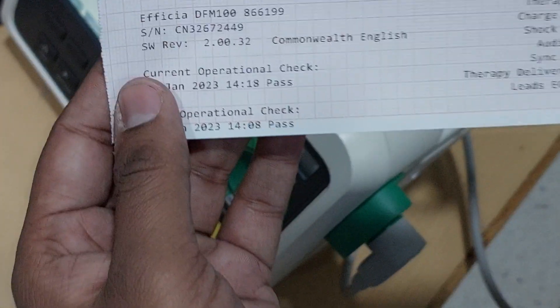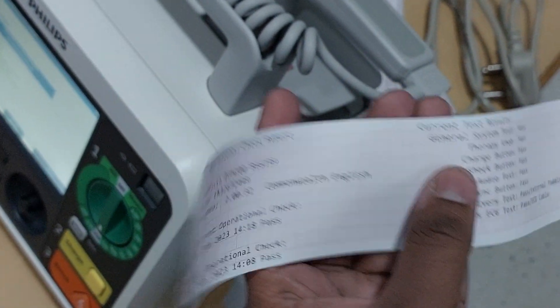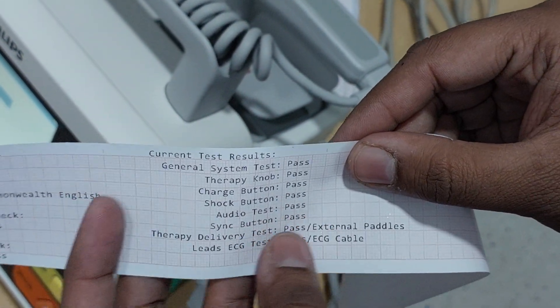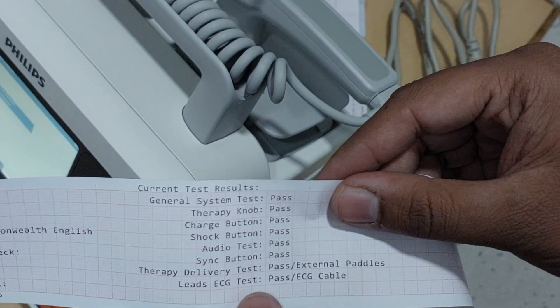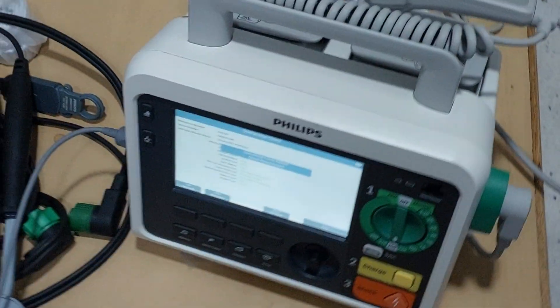You can observe the printout — this is the Efficia DFM100 serial number. Under General System Test: Pass. Therapy Knob: Pass. Charge Button: Pass. Shock Button: Pass. Audio Test: Pass. Synchronous Button: Pass. Therapy Delivery Test: Pass. External Paddles: Pass. Lead ECG Test: Pass. That means this machine is working fine and you can use it directly for the patient.